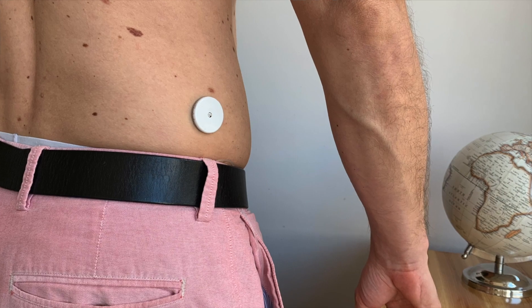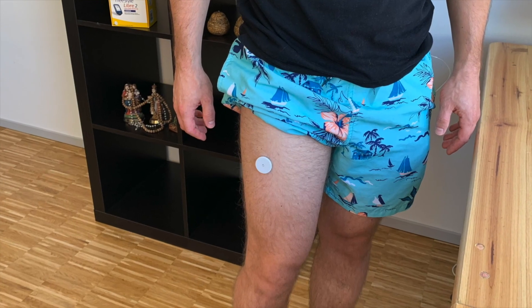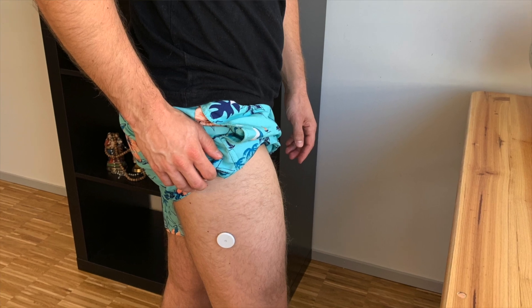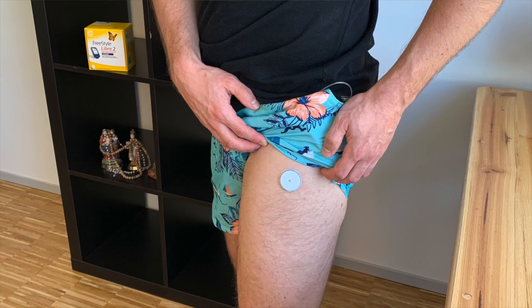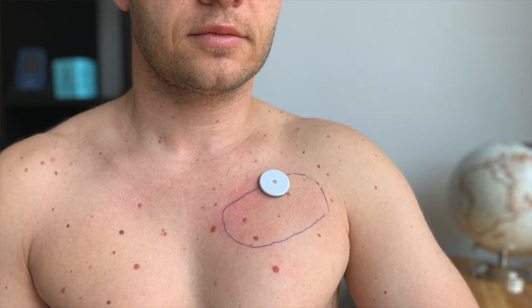Another thing I haven't been told is that using alternative sites beyond just the upper arm is something I can actually do. I've experimented with more than five alternative sites, and two work really well for me: chest and thigh. I find both very comfortable and accurate, and I use them from time to time to give my upper arm some rest. Just keep in mind that none of the alternative sites are approved by regulators, so trying one is at your own risk.